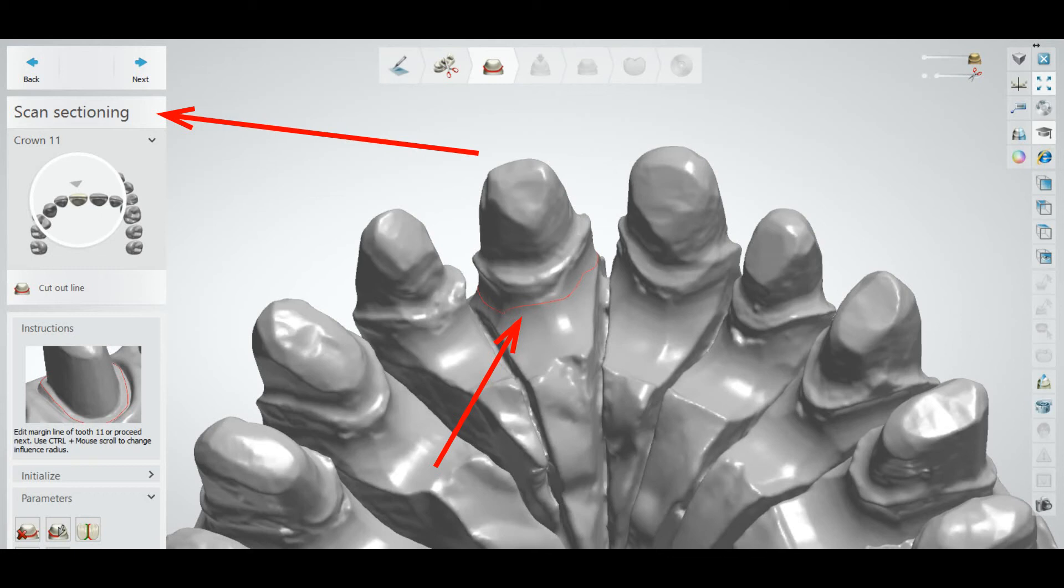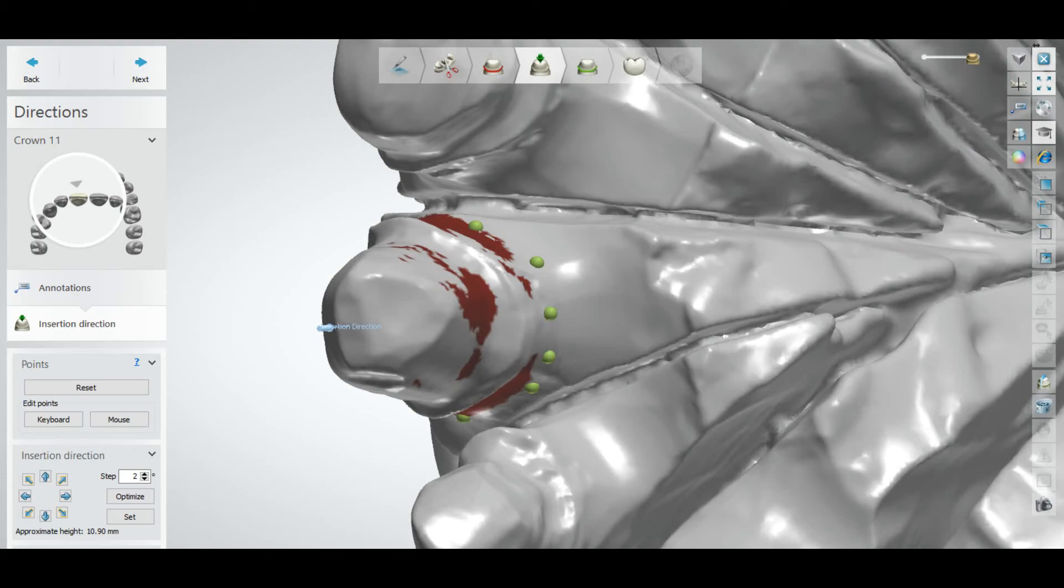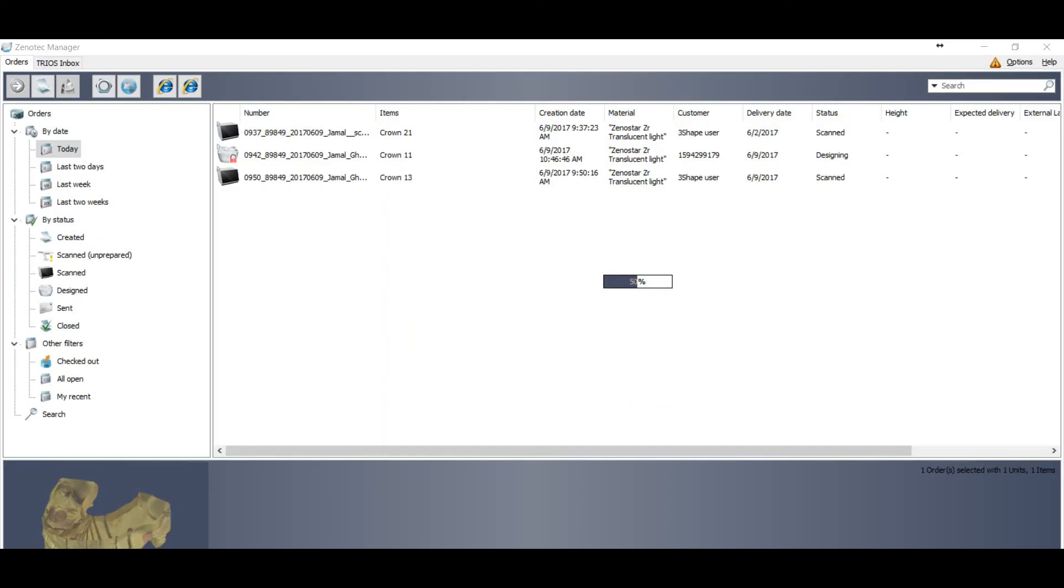After sectioning the scan, go to the next step, save your order and close it.